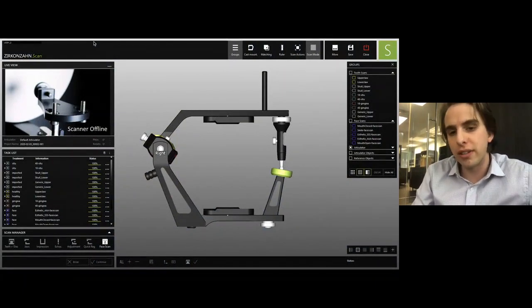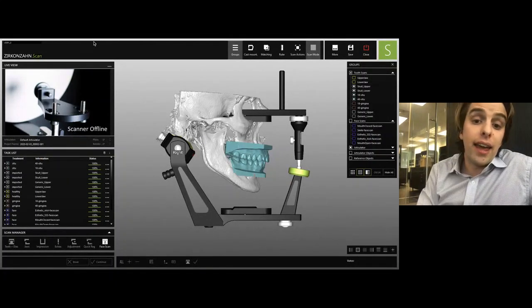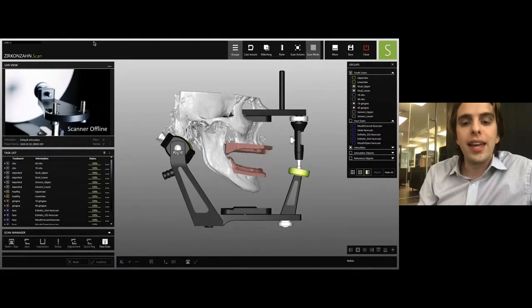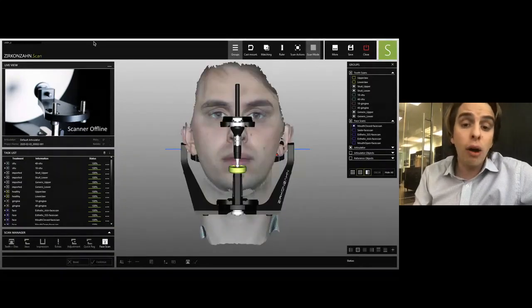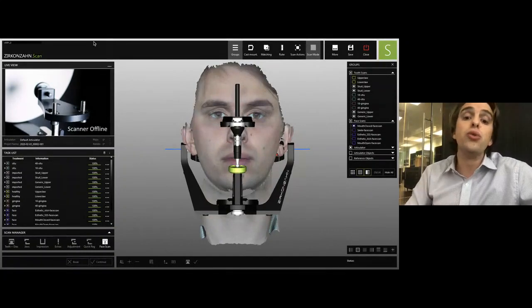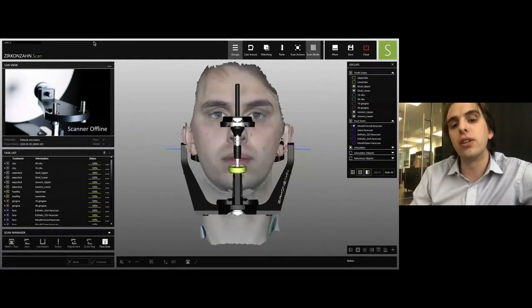established on a virtual articulator. We have the situation models mounted in relation to a STL rendering of the skeleton data. We have the edentulous models. So this we can imagine is a patient that is edentulous with the complete denture. And all of this was mounted because we had 3D face scans that we used, and through a specific set of references, translated the maxilla into the virtual articulator.